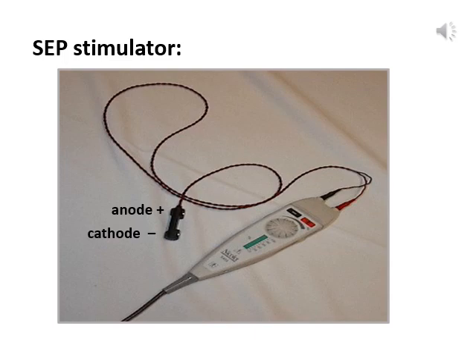It's always a good idea to start at 0 and slowly dial up until the motor threshold is obtained. This motor threshold is seen as a thumb twitch with a median nerve stimulation and a plantar flexion or a downward twitching of the big toe with a posterior tibial nerve stimulation. The electrode is plugged in with the red pin to the positive and the black pin to the negative jacks. The electrode is bipolar with the anode closest to the wire, and the cathode is the electrode further away from the wire.